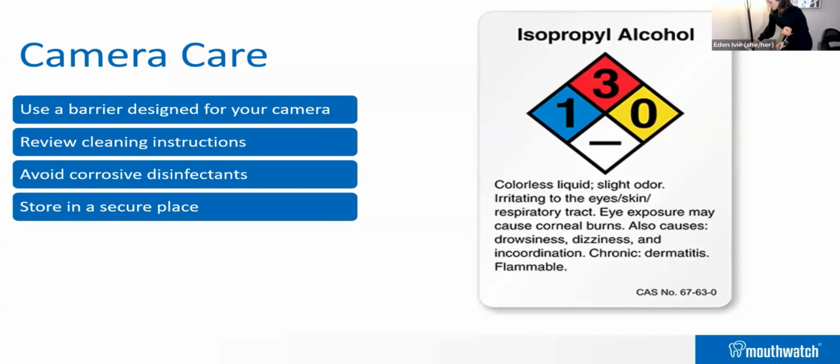Okay, so that's it for my camera techniques. The last thing I want to cover, and we'll just cover this quickly, we're just about finished, is taking care of your camera. If you are not taking good care of your camera, it is not going to continue to perform and you're not going to get good images.